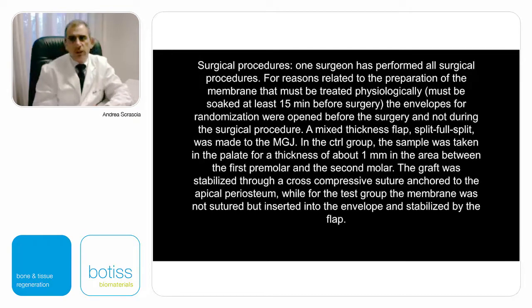The surgical procedures: one surgeon performed all surgical procedures, for reasons related to the preparation of the membrane, which must be soaked at least 15 minutes before the surgery. The randomization envelopes were opened before the surgery and not during the surgical procedures.